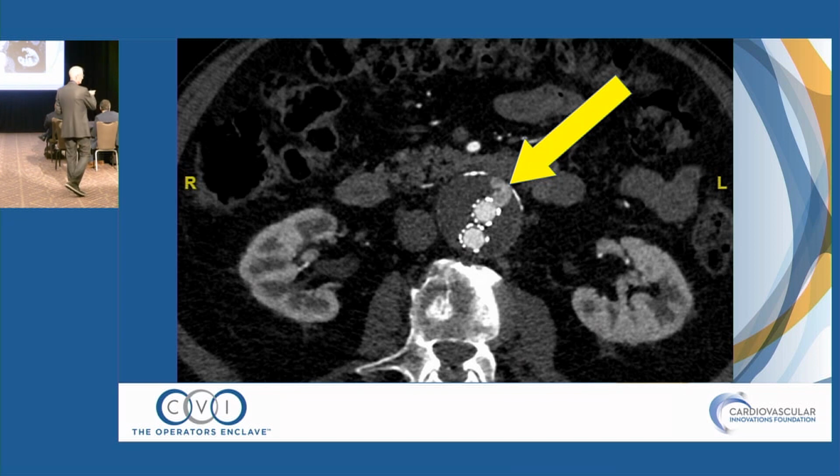So the question from Dr. Rosol is the key question, is the aorta enlarging? And the answer in this man is no. His aneurysm was 5.2 last year when it got fixed. It's 5.2 centimeters now, so it's not enlarging. It's a low pressure, probably retrograde endoleak, so you probably leave this alone.